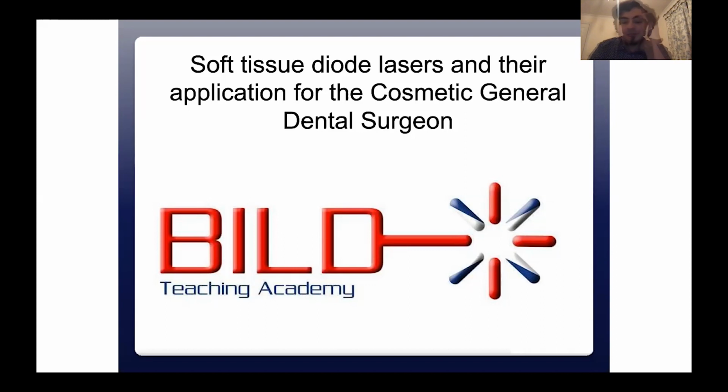So what lasers exist in dentistry? You've got two particular types. You've got soft tissue lasers and you've got hard tissue lasers. And today we're going to concentrate slightly on the physics behind it. And tomorrow we're going to touch into a bit more detail about what it can be used for. So the majority of us, being general dental practitioners, will only ever need to know how to use a soft tissue laser for our use in dentistry.